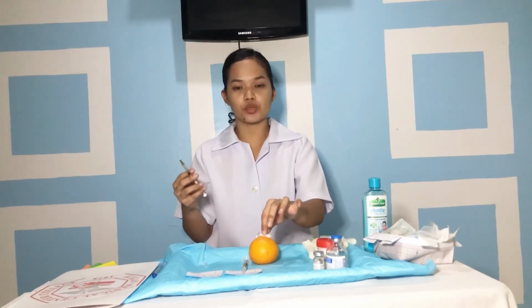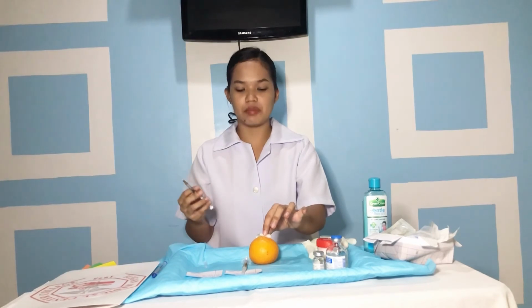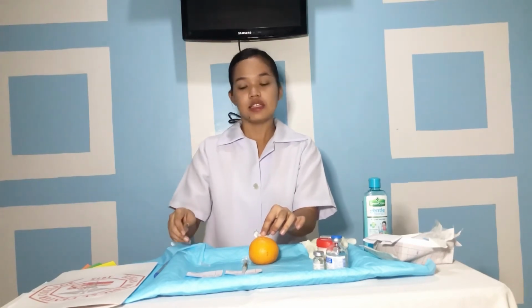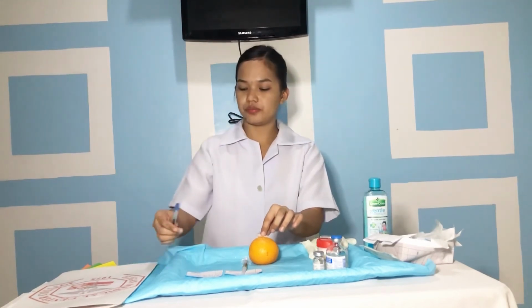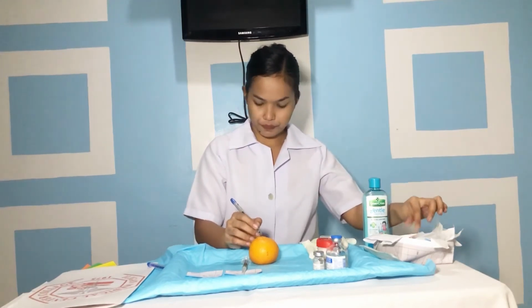Support of tissue around the injection site minimizes discomfort during needle withdrawal. So we should not massage the site because massaging causes underlying tissue damage. So then we draw a circle around the perimeter of the injection site and discard the needle enclosed in its safety shield and attach the syringe into a puncture-proof container. So this will prevent injury to the patient and healthcare personnel.